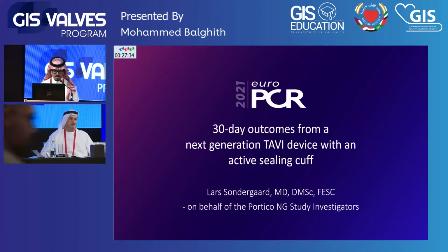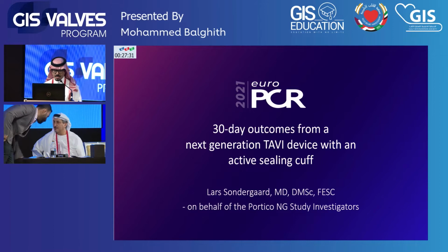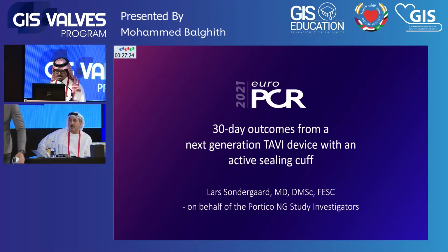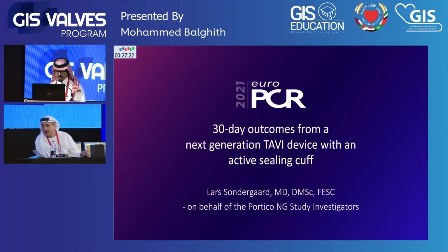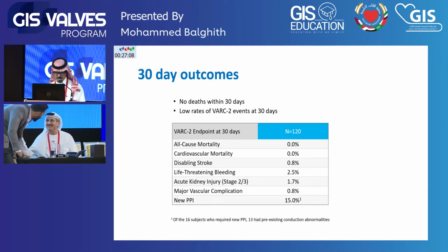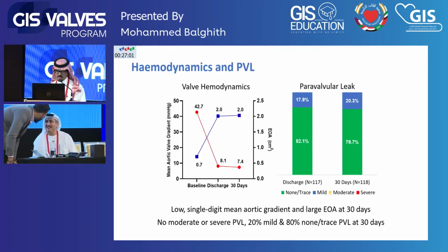The 30-day outcome was presented at PCR 2021 by Lars Søndergaard from Denmark. It showed the 30-day outcome for the next generation, which is Navitor. As you can see here, they had about 120 cases and very good results in comparison with other valves. The new pacemaker implantation rate here is 15%, and they commented that 13 of their patients already had pre-existing conduction abnormalities.